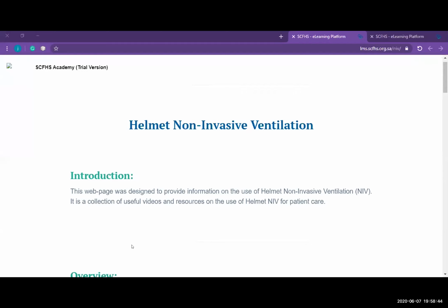And just to quickly repeat what Dr. Sami Sulami said, for our non-Arabic speaking colleagues: this whole workshop is recorded and is going to be uploaded on the website. He did stress the point that this is not an alternative for intubation. As we mentioned earlier, one of the contraindications is that a patient in severe respiratory distress should be intubated and should not be bridged with the helmet, because this might lead to delaying a more effective and life-saving therapy for those patients.